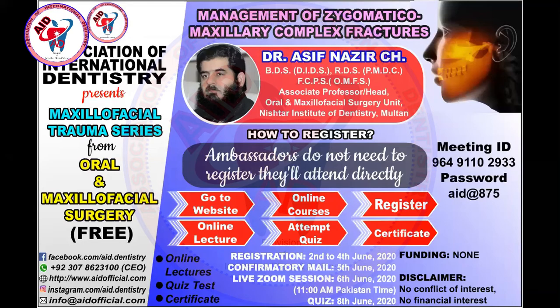Or you can make a hole in the frontal bone, and also in the zygomatic bone, pass a wire and pull that wire, and at the same time push that segment with the periosteal elevator. Depending upon the situation, you reduce that area, and once you have reduced, then definitely what will you do? You have to select your fixation technique.